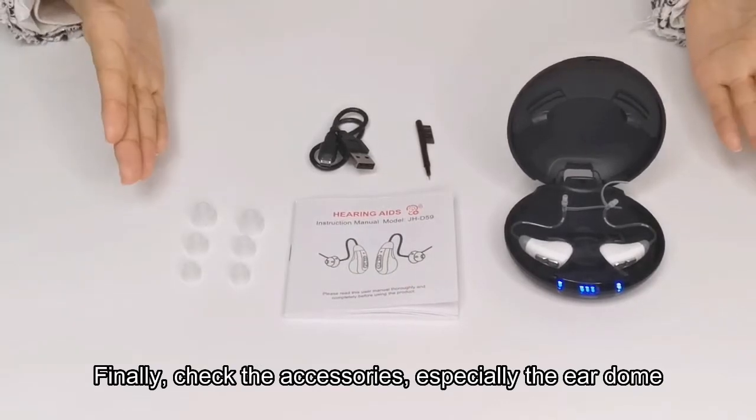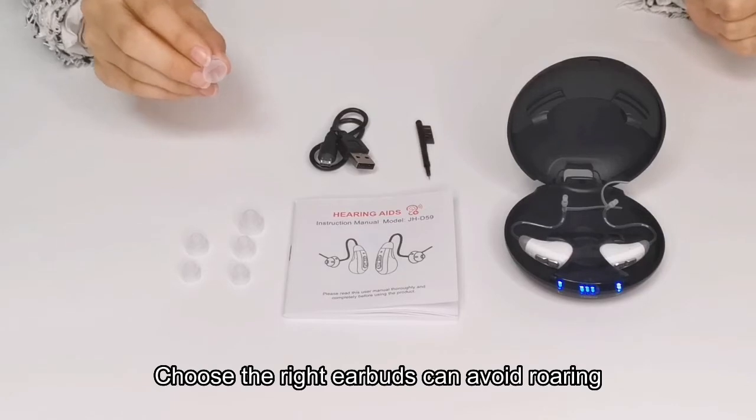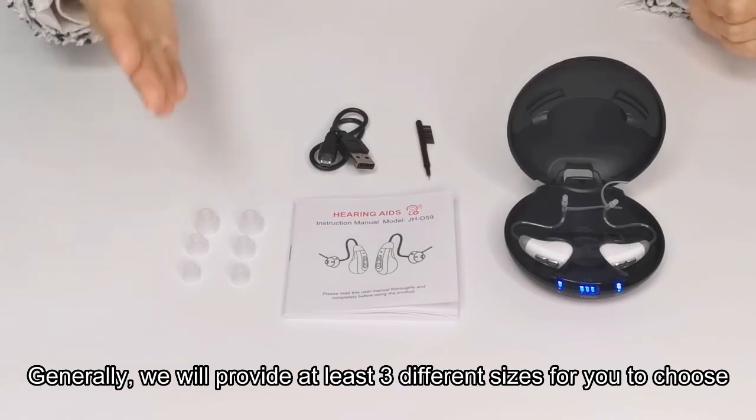Finally, check the accessories, especially the ear dome. Choosing the right size of the earbud can avoid roaring. Generally, we will provide at least three types of sizes for you to choose.